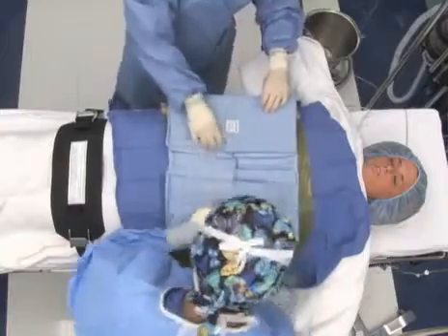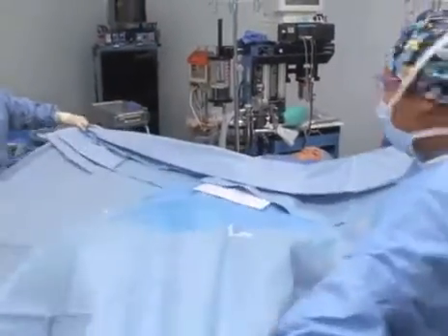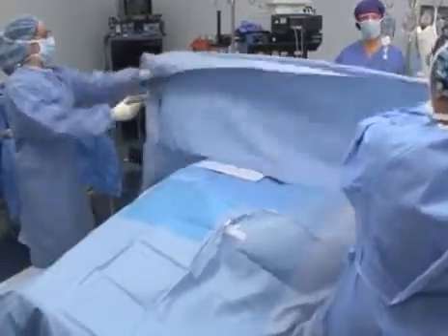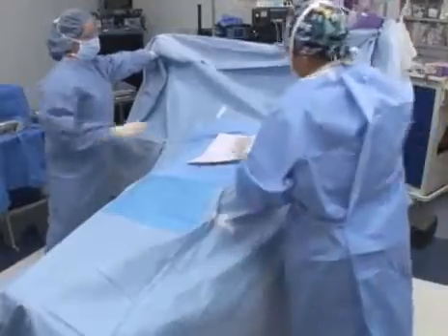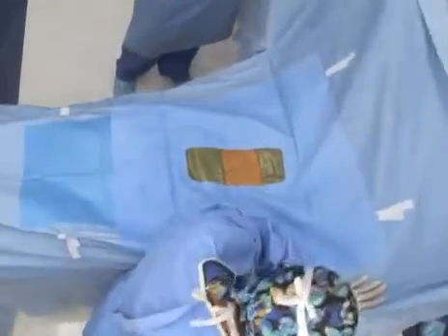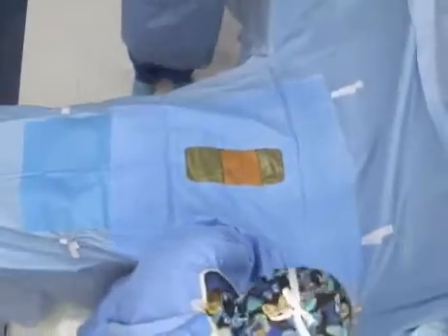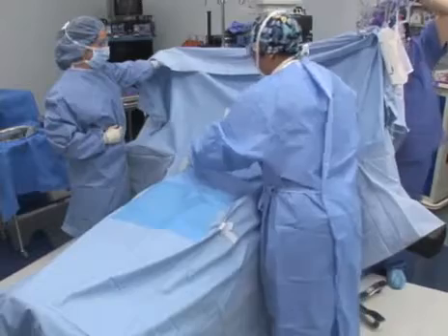The surgical technologist and surgeon usually apply the drape together. The last drape to be applied is the top drape, also called a procedure drape or specialty drape. The specialty drapes are fan-folded and compact. The folded drape must be positioned over the surgical site correctly before it is unfolded. It cannot be shifted once it is positioned, so it must be correct the first time.